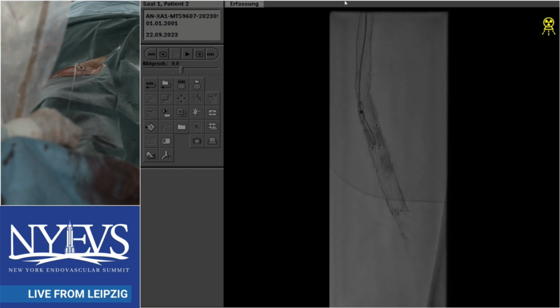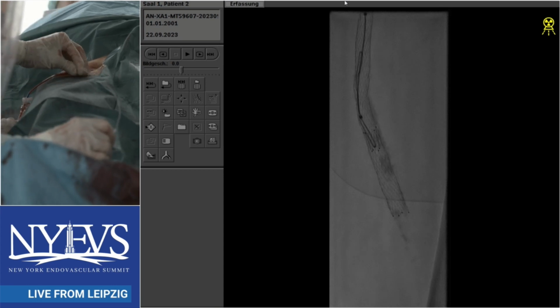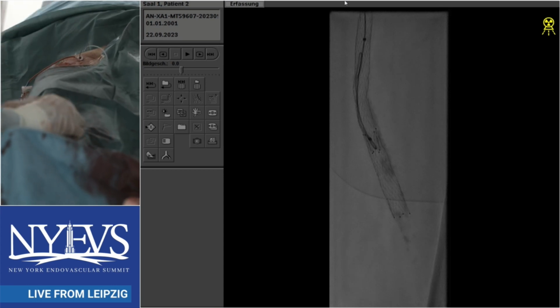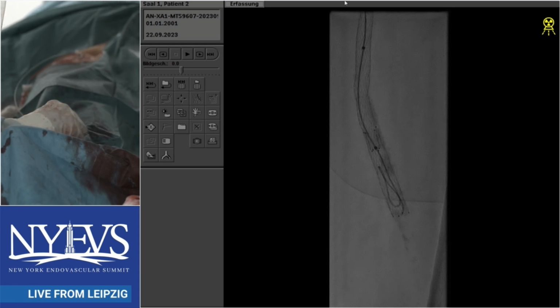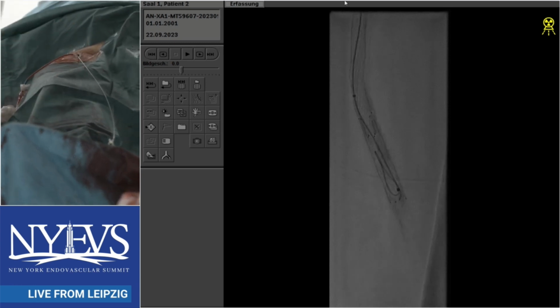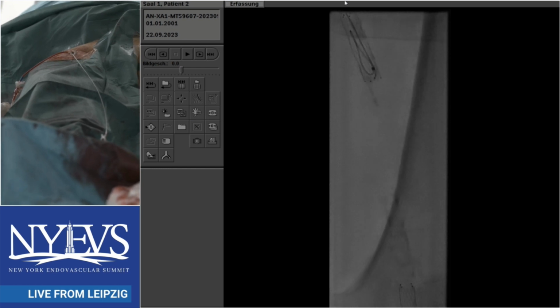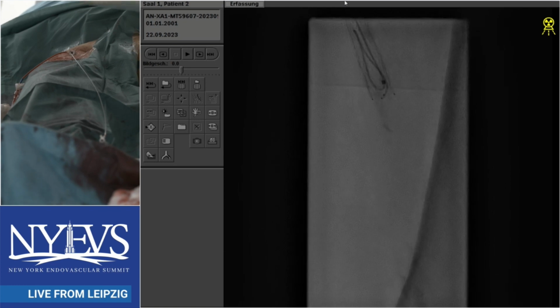Right. And again, rest pain is a different indication from claudication. But I'm wondering if we can move on to that at some point, if you're failing surgery and endo. He's had several attempts, surgical and endo, so maybe we're not addressing the outflow issue. He definitely has. His pedal arch is also compromised. It's a 2A, I believe. It's a single, so it's only the DP. So yeah, definitely. Great discussion.